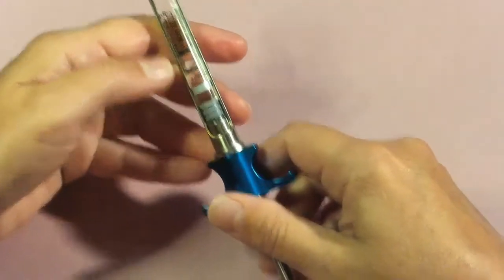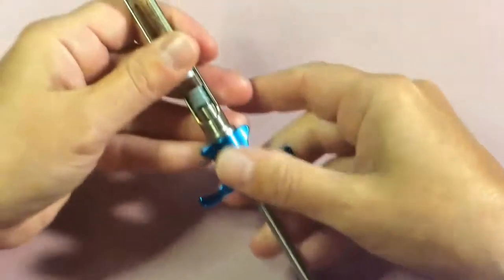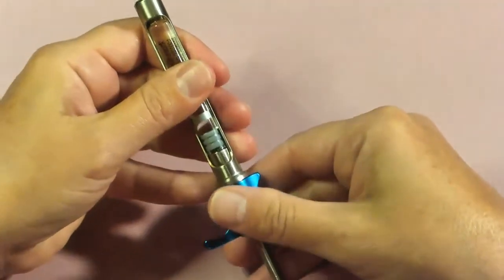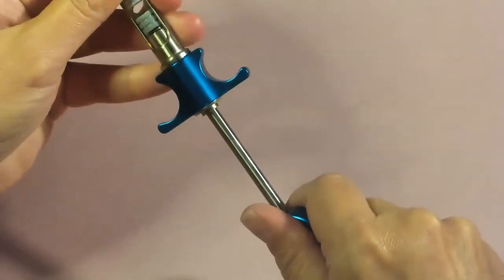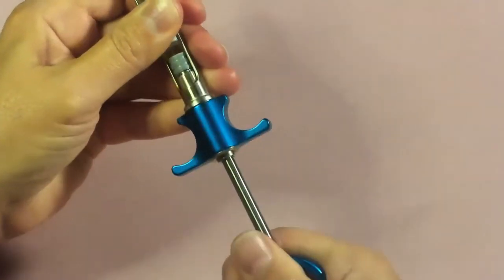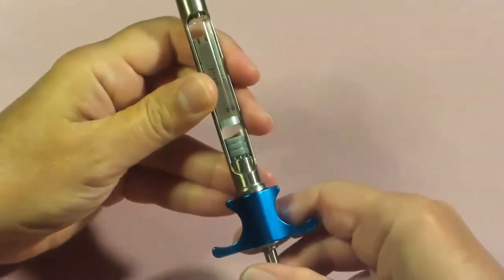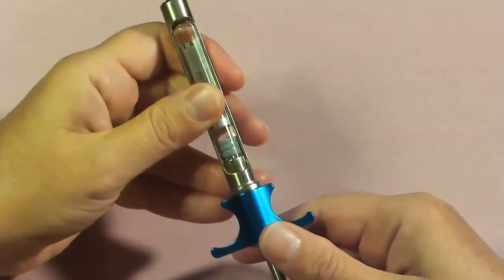At this point we want to go ahead and engage our harpoon. To do that, hold the cartridge in place with your thumb on your non-dominant hand, and with your dominant hand push in on the thumb ring firmly and slightly twist. I suggest doing that two times — push in and twist. If you then pull back on the thumb ring, you'll see it's pulling back on the entire cartridge, so we know the rubber stopper and harpoon have been engaged.